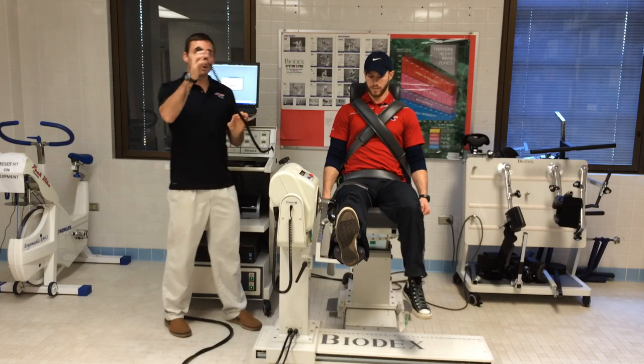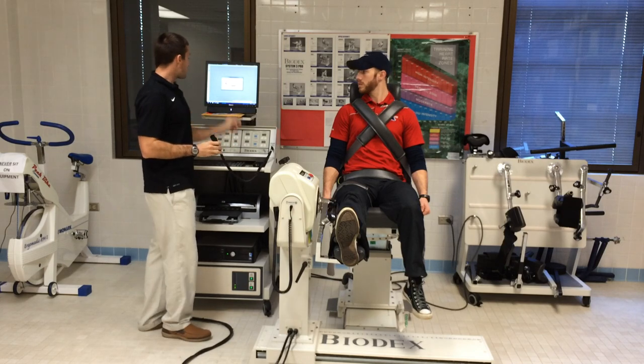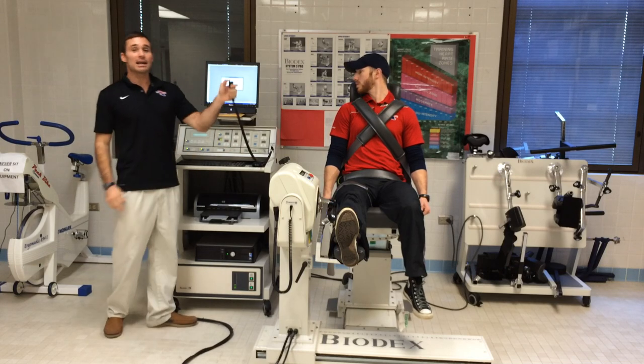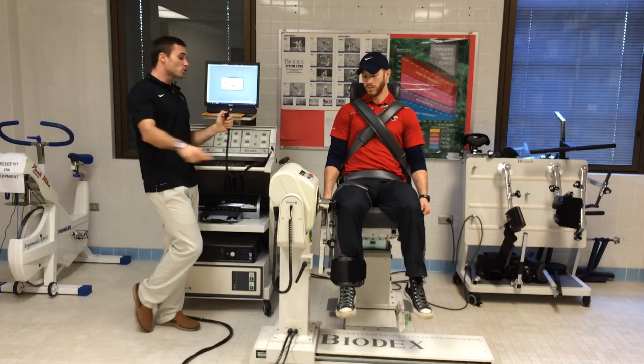Very good. By clicking this button, I've now locked him in. He doesn't have to hold that position. And then I can come to the computer and it will say away limit. I'll hit set. After I hit set, I'm going to click this button again. His leg is free. Bo, I want you to pull it as far toward you as you can.